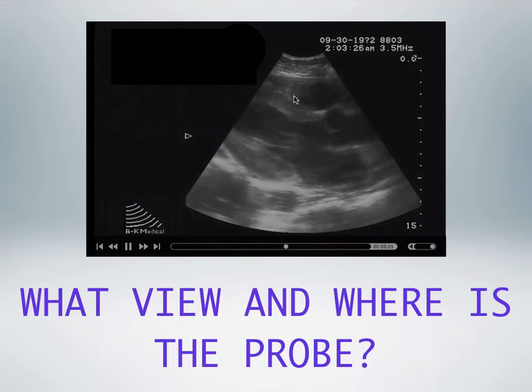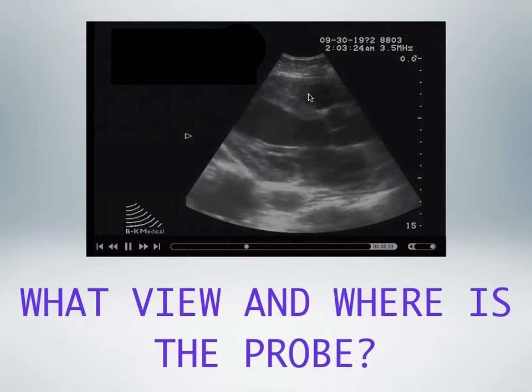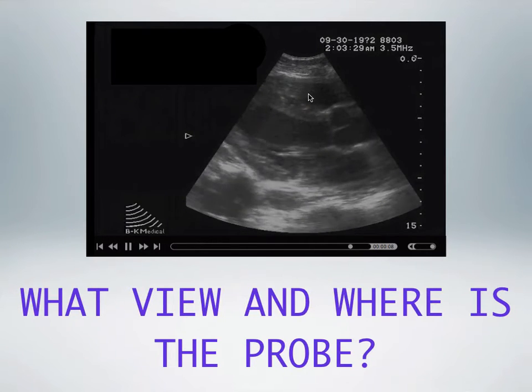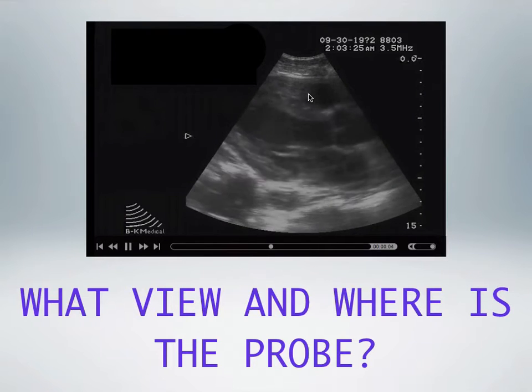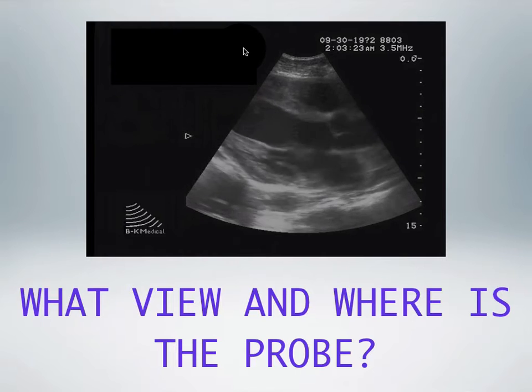And then anterior to all this is the right ventricle. And we know in trauma cases, the right ventricle is most anterior. That's the one that gets injured in blunt chest trauma, like a myocardial contusion in a car accident where the steering wheel hits the chest. In penetrating trauma, it's the right ventricle that gets injured with, for example, a knife. And where's the probe? The probe is to the left of the sternum, aiming at a 45-degree angle to the hip if you're performing this with the dot, which is not seen on this image, located where the arrow is.